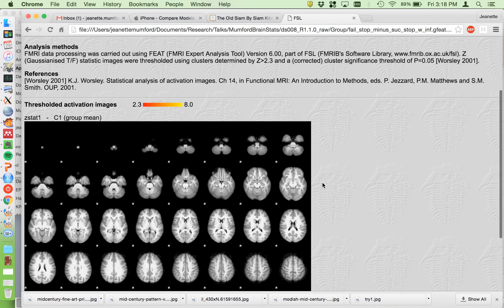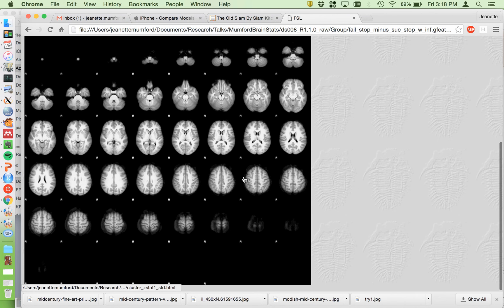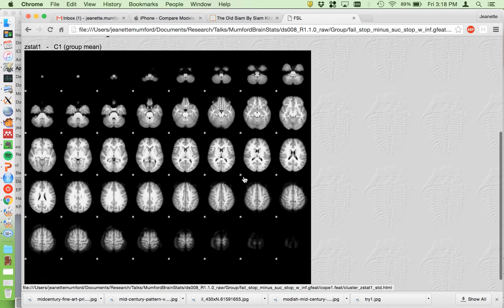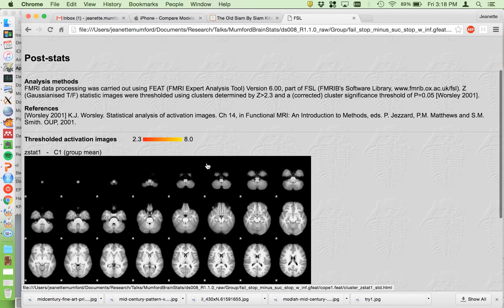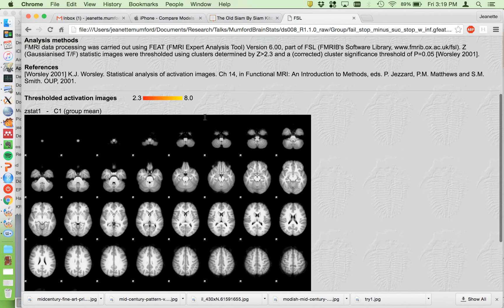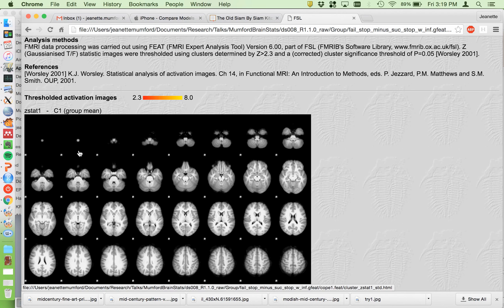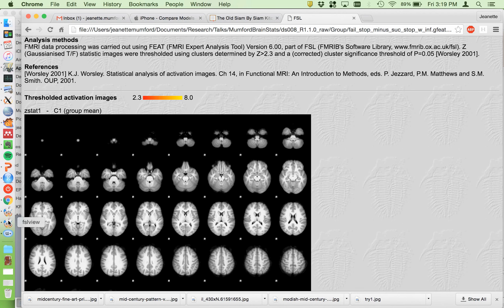But you can look here, but I generally prefer looking in FSL view to looking here because I can't click around or anything. So don't just use this. Always load it up.